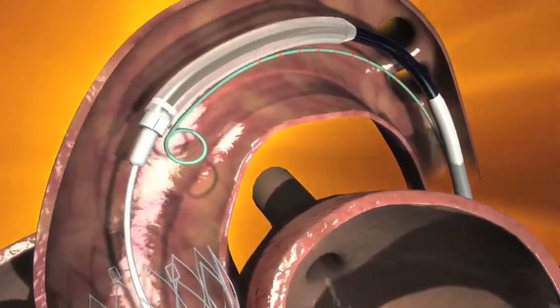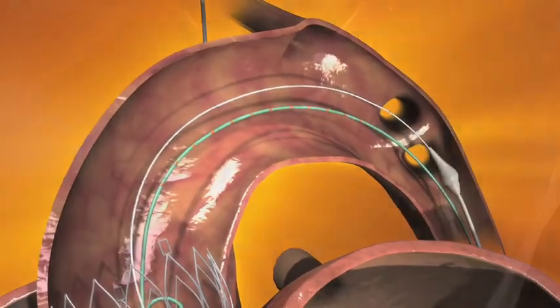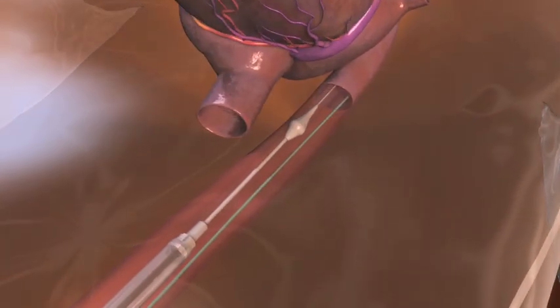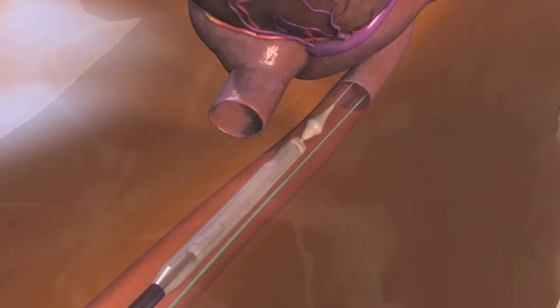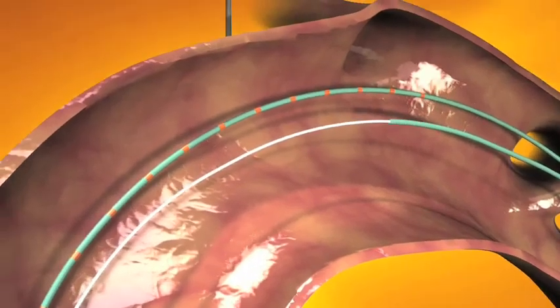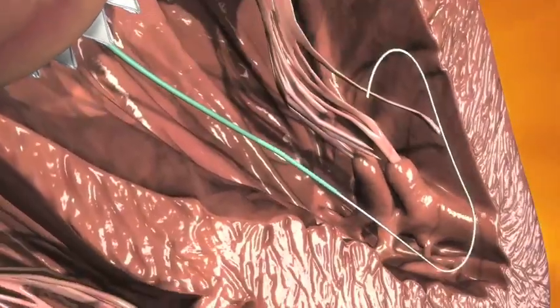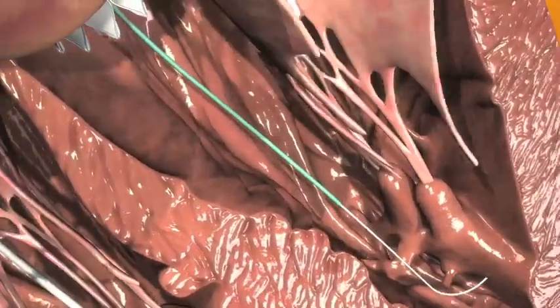Withdraw delivery catheter to the descending aorta while maintaining guide wire position. Close the delivery catheter capsule and remove the delivery catheter over the guide wire. Advance a 6 French pigtail catheter over the guide wire into the left ventricle. Remove the guide wire and connect the pigtail catheter to the transducer.